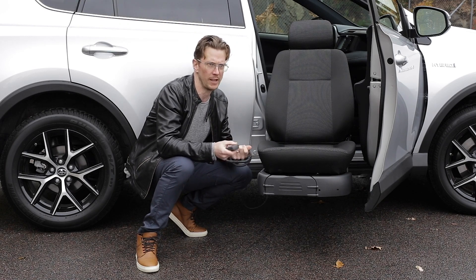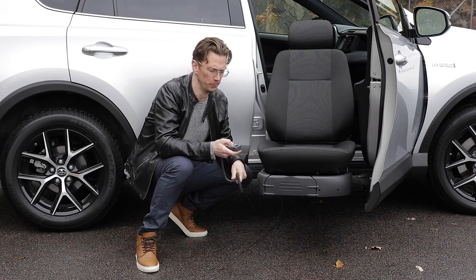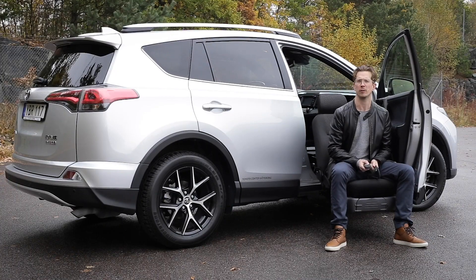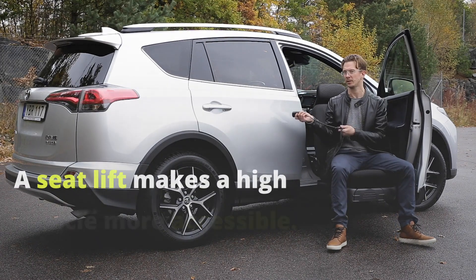And if you're sitting down from standing up, you can do it at a height that's comfortable for you. A seat lift would typically be installed in a higher vehicle such as this, a Toyota RAV4.